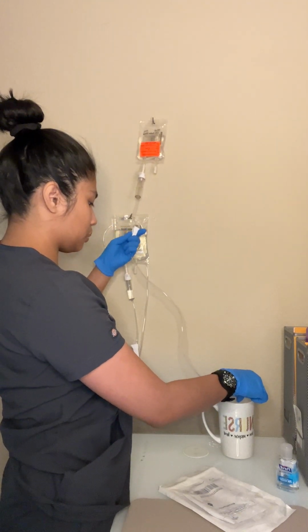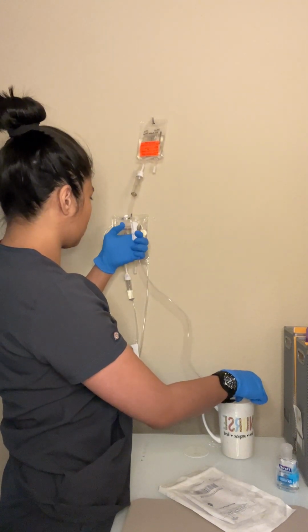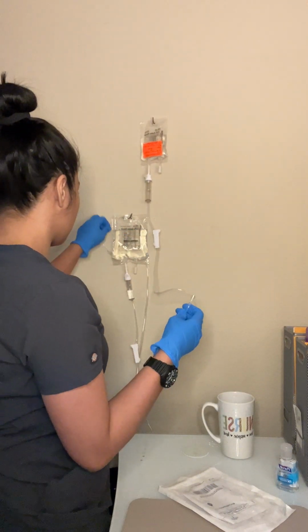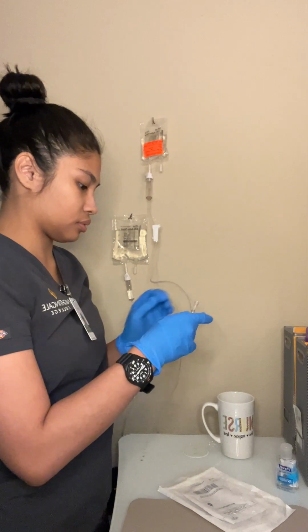Letting a couple drops come out. Next, we'll be connecting this to the Y port.